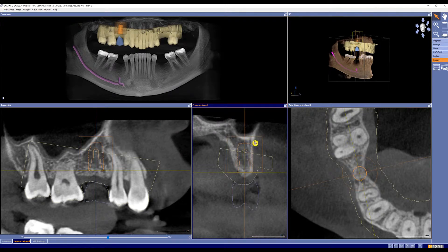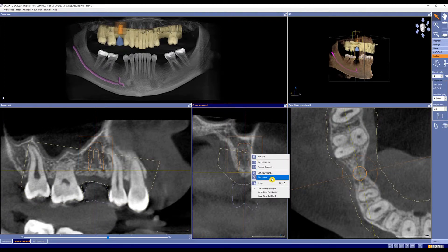That's because for CEREC Guide 2 we need to add sleeve information. To do that, we're going to right-click on the implant and hit edit sleeve.